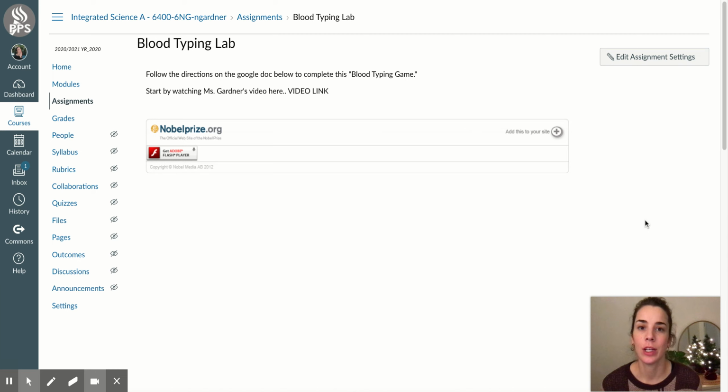This video is going to show you or explain how to do the blood typing lab. On Monday and Tuesday, we talked about the different types of blood, the name tags that our blood has, how your blood type is determined, and hopefully you finished your notes and were able to look at blood transfusions and how the blood types can be compared or added to each other. Those notes are going to be helpful for this activity today.